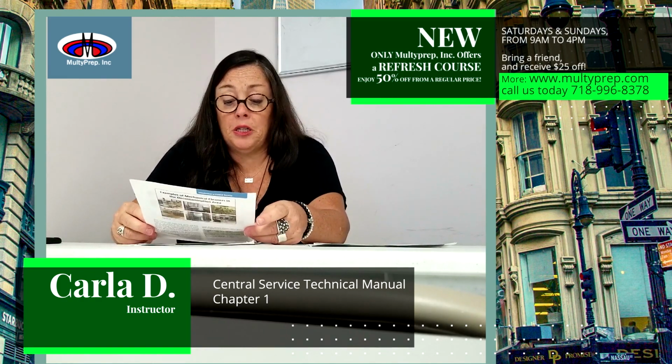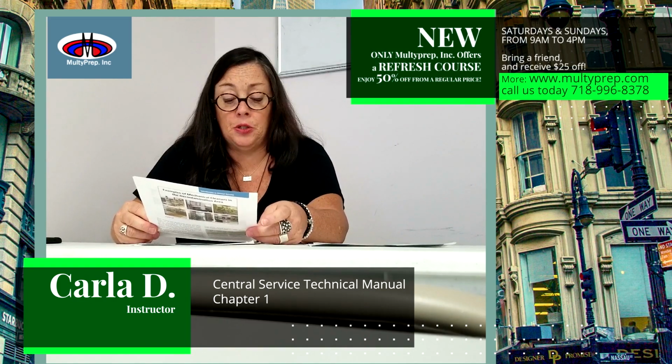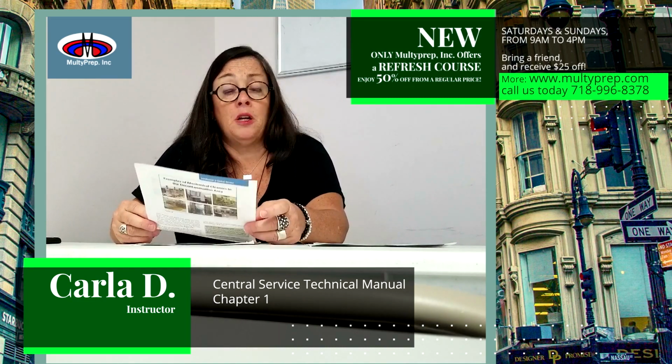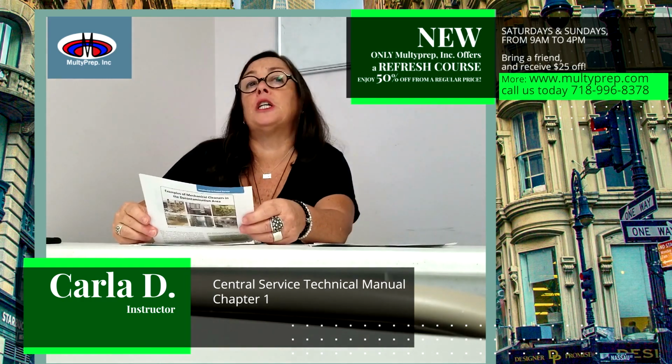Surgical specialty instruments, equipment, and implants also require special knowledge and expertise. CS technicians must be able to select the proper packaging system and use proper techniques for wrapping and packaging items for sterilization.